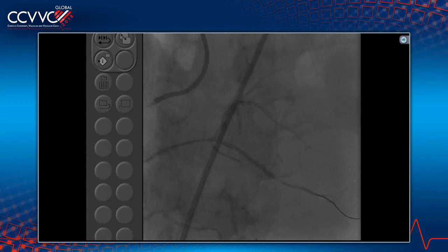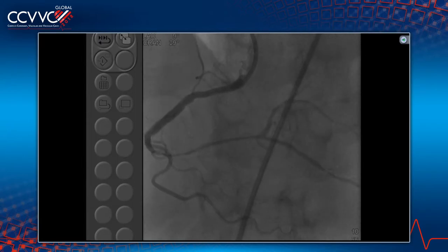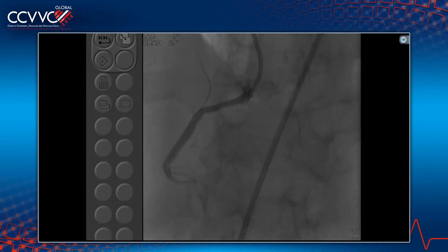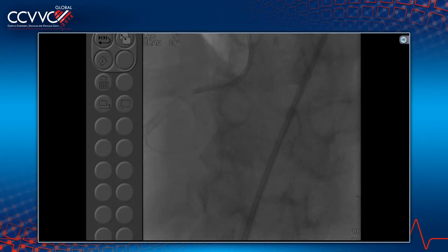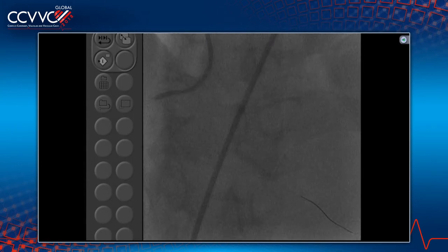Well, it's good. You don't want to go in with a 2.5/30 balloon before you go any further. No, more important, we may have to do a Wolverine of that ISR of that PDA. Well, it looks kind of good already. There's an edge lesion there, it's not really inside that lesion. So I think we will restent that and we will take a longer stent, PDA.